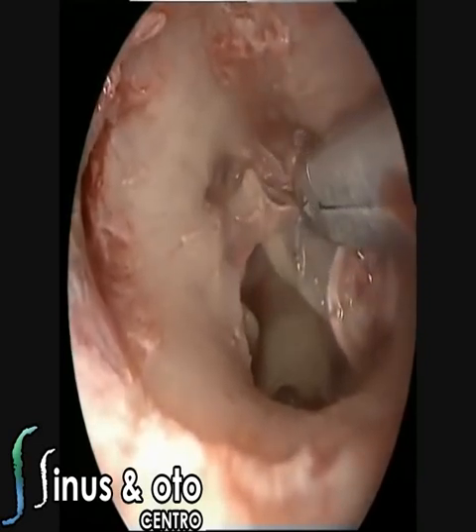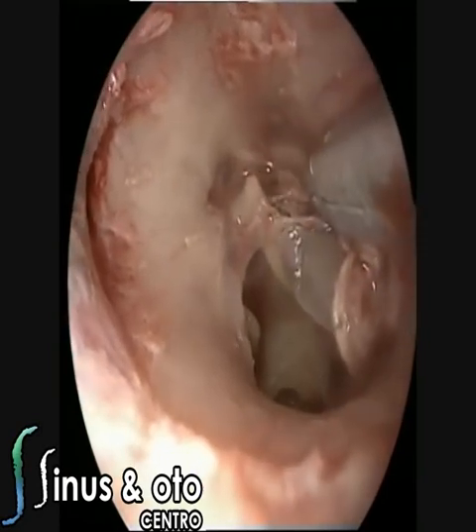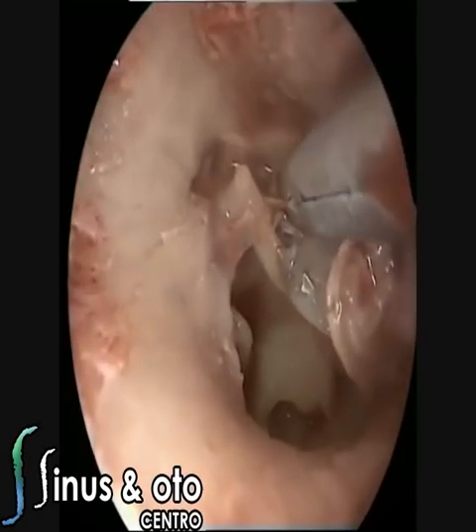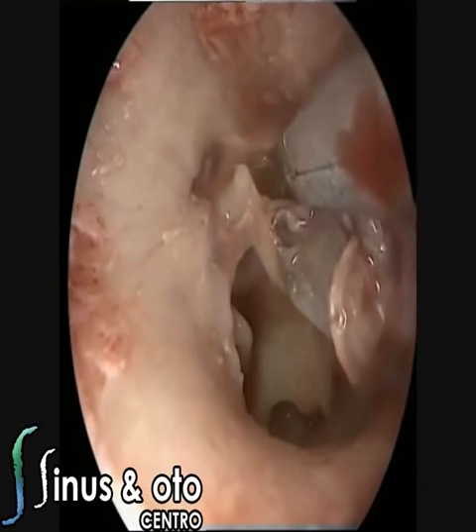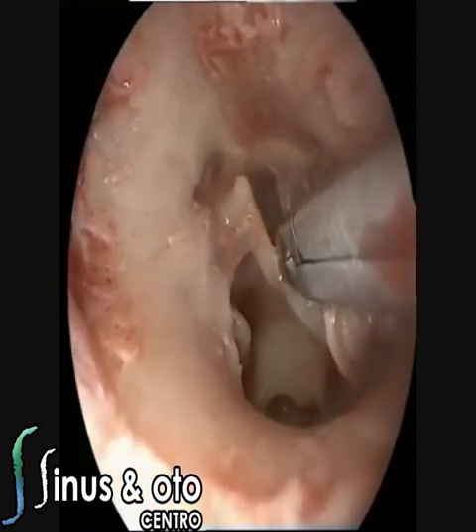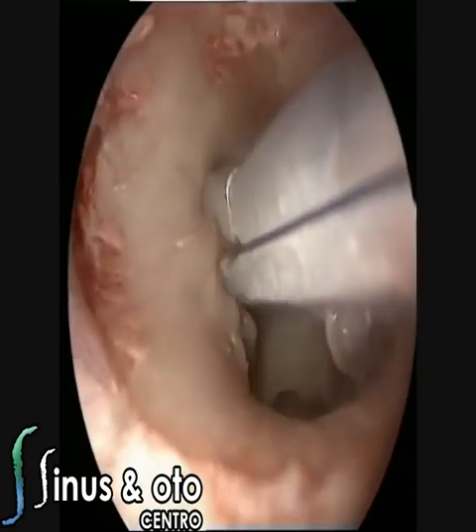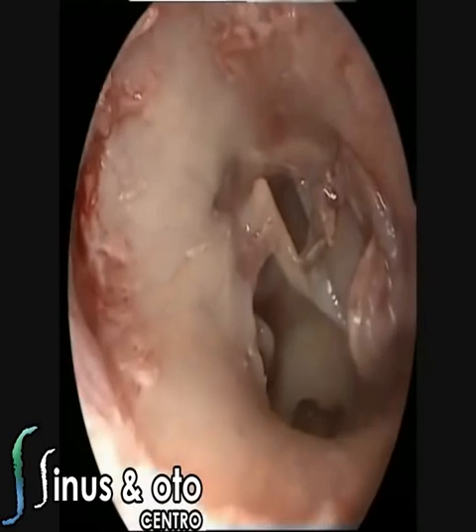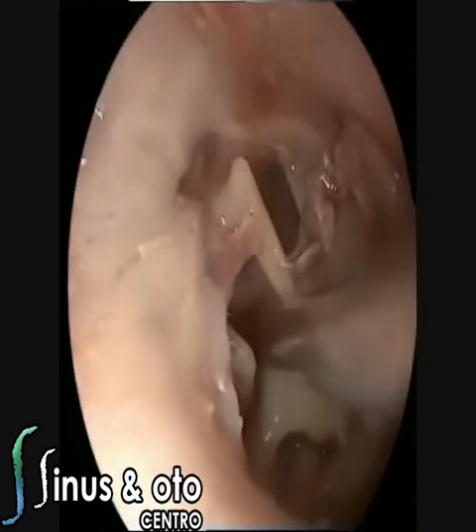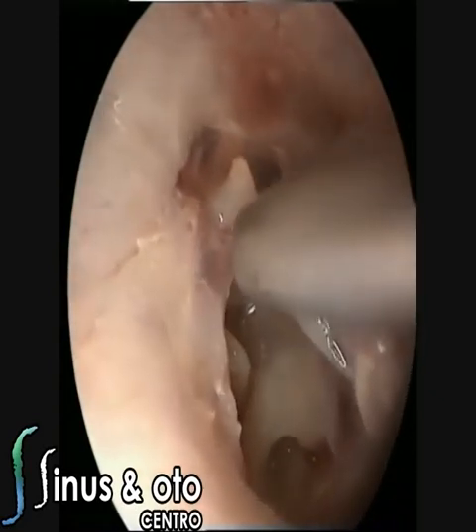And we are elevating the tympanic membrane from the malleus also to open the anterior epitympanic spaces and to open the supratubal recess space. So it's a very big dissection and a very big elevation of the tympanomeatal flap. But this can be done also in surgery. If you want to inspect the anterior compartments of the middle ear and the anterior epitympanic space, you have to understand that you can remove the tympanic membrane all the way from the malleus.